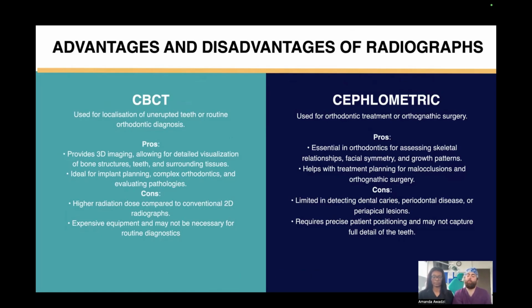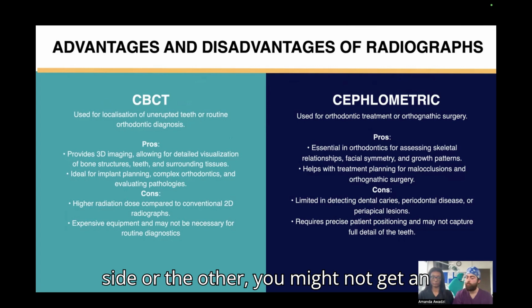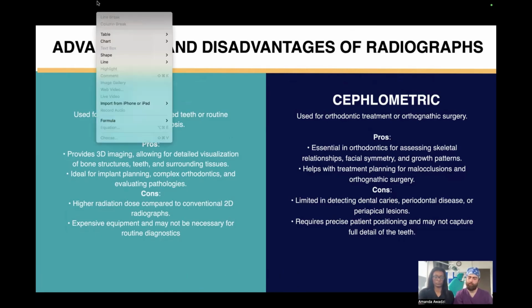And yeah, it requires precise patient positioning as well. So if you move the patient slightly to one side or the other, you might not get an accurate picture and it can kind of mess everything up. So it's quite technique sensitive.